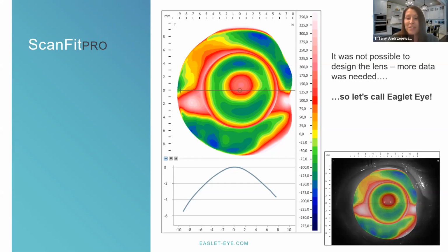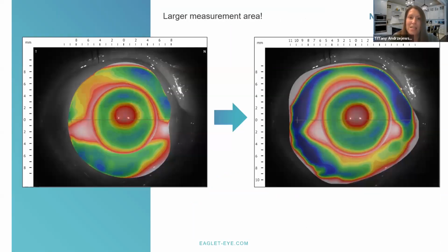I look at the images and the tangent angles and everything. I'm like, this looks great. We've pried his eyes open. He's not dry. We use tears. I don't want this poor guy to stay out of lenses again for another 5 days and give us a go. So Reinier, if you go to the next slide, this is that same scan that Reinier reprocessed for me. I looked at that and I said, hey, we've got something to work with now. So I sent that over to David Slater, and it made all the difference in the world.